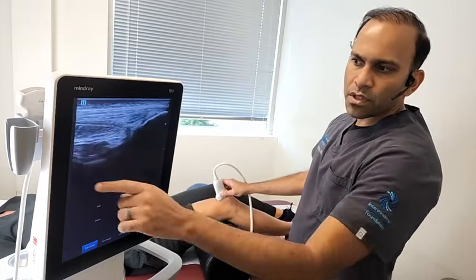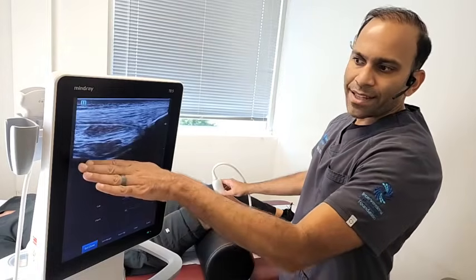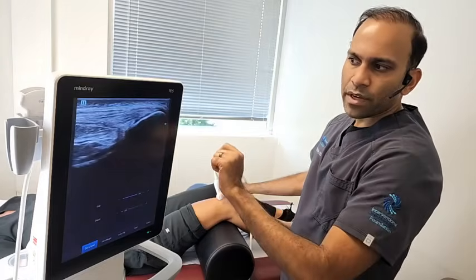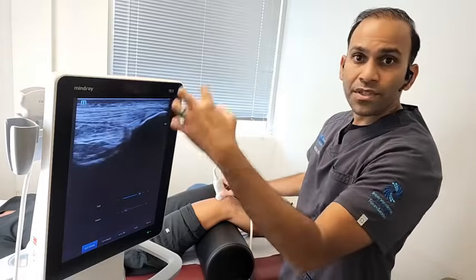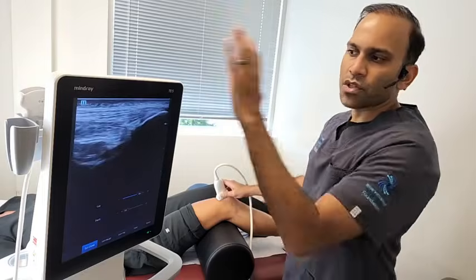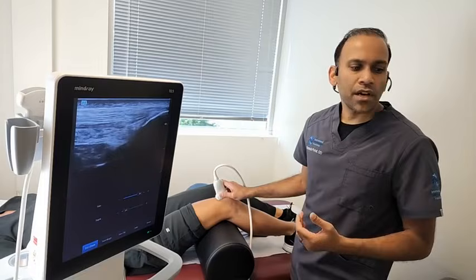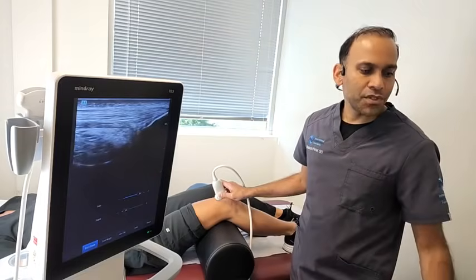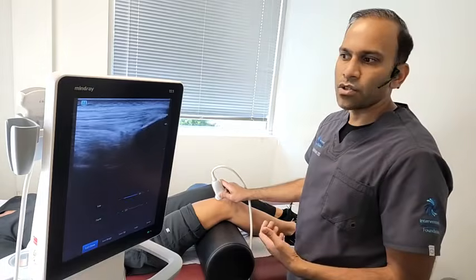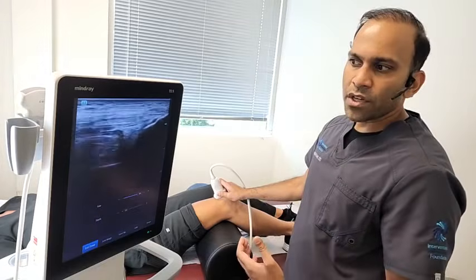Now as we go deep, we can see this bright white structure here is the thigh bone. We can't see anything past the thigh bone here, and we can't see anything past the kneecap over here, because this is bone, and all of the sound waves being sent in by the ultrasound are bouncing off of these bone structures, and therefore we can't see deeper than that. So one of the disadvantages of ultrasound is that we're not able to see deeper structures the way that X-ray and MRI and CAT scan can. But you can see that for these superficial structures, it's very accurate, with a really great amount of detail.